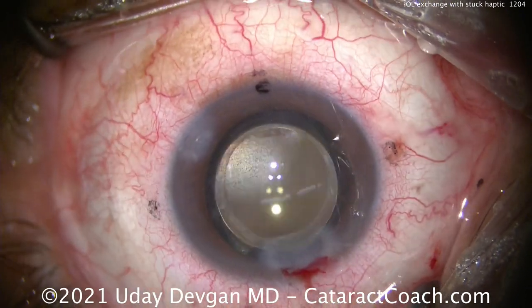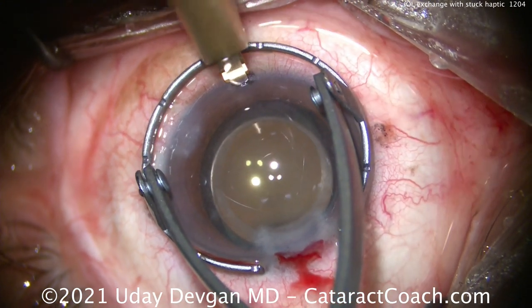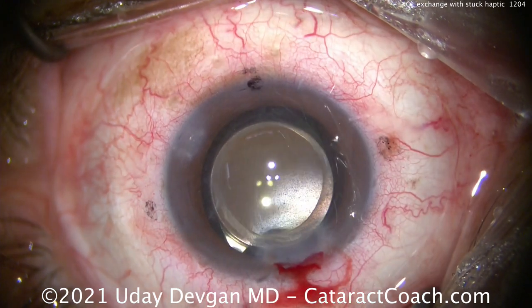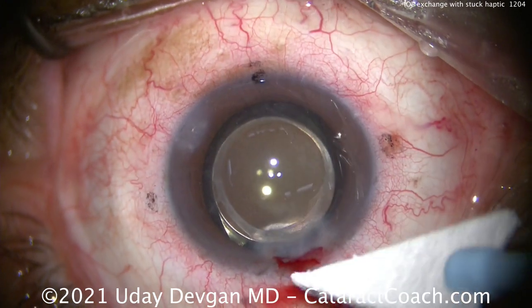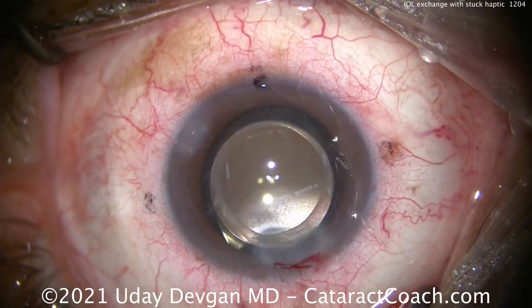We're not quite done yet — we've got to do a matching limbal relaxing incision. Here it is, opposite the main incision. We're going to correct about 0.75 diopters of with-the-rule astigmatism. The patient had a beautiful surgical procedure.